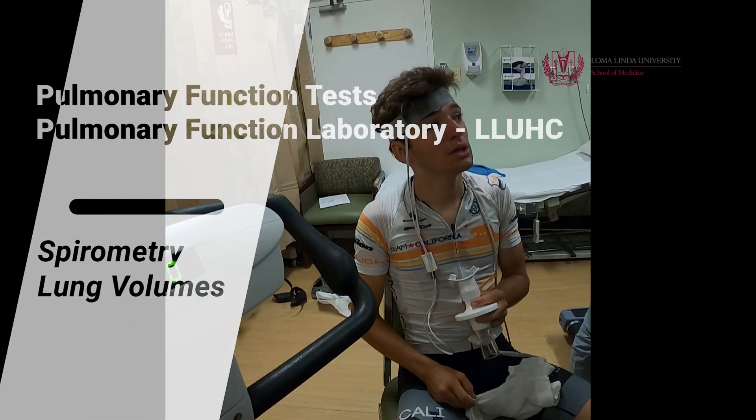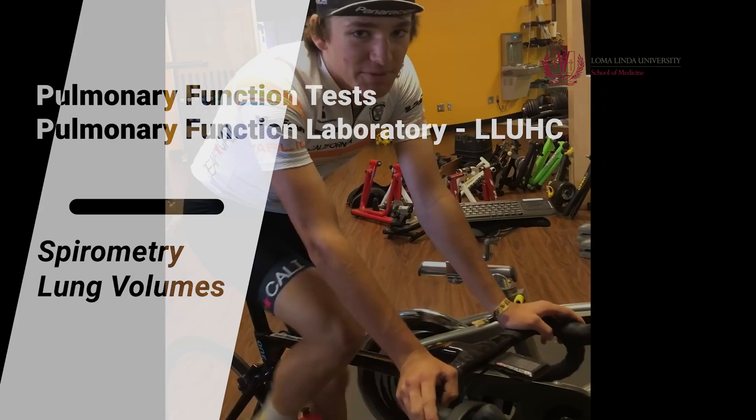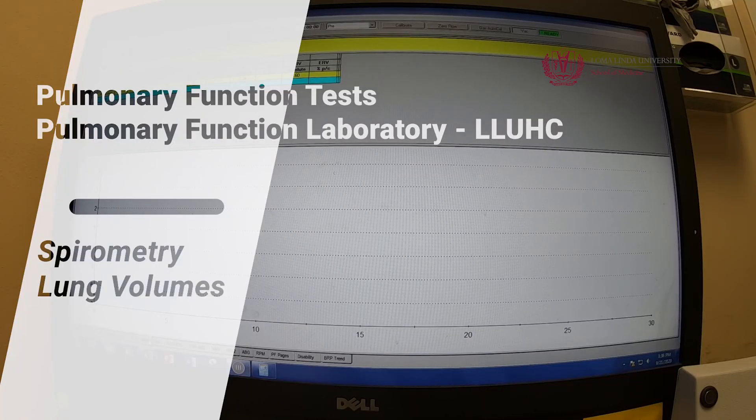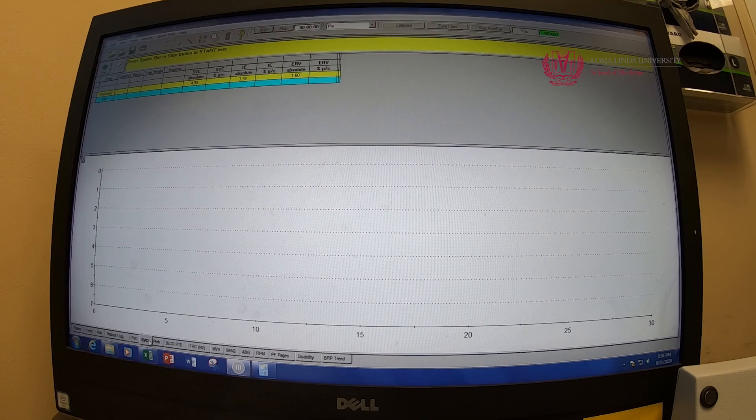So first test — what I'm going to have you do is start with nice and relaxed breathing. When I tell you, you're going to take the largest breath you can — real big breath — and then you're just going to let it out easy, then push it the other way. You'll start with normal breathing, then a huge breath in, and then let it out easy like you're deflating a balloon, and just keep pushing that air out until I tell you to take another big breath in. Okay, start nice and easy — good, nice and relaxed breathing.